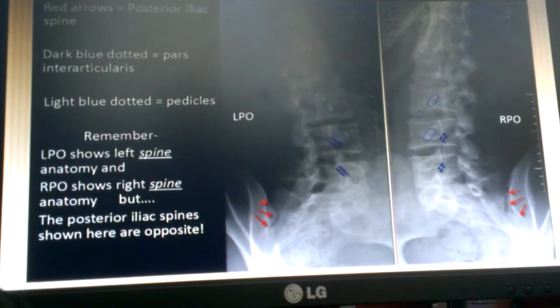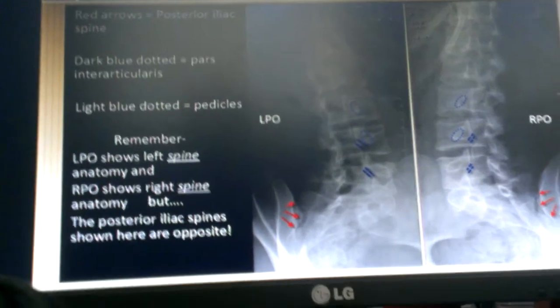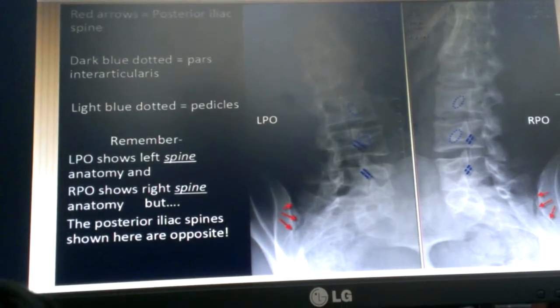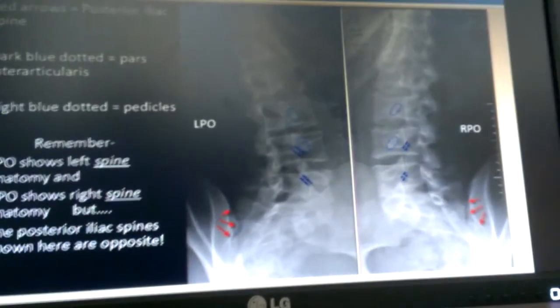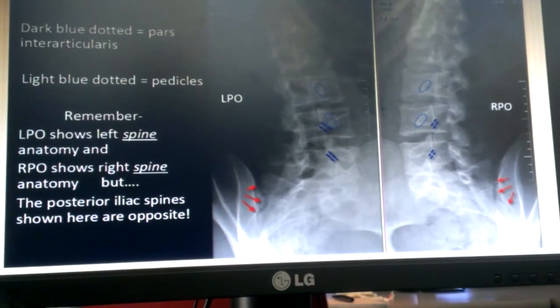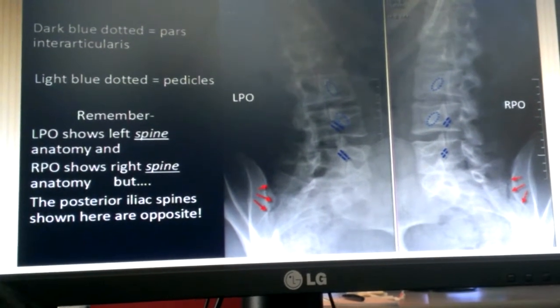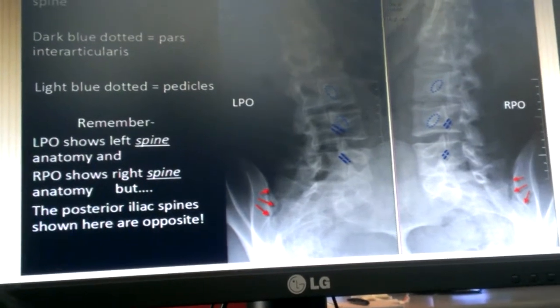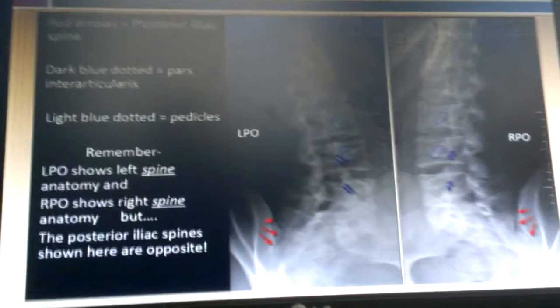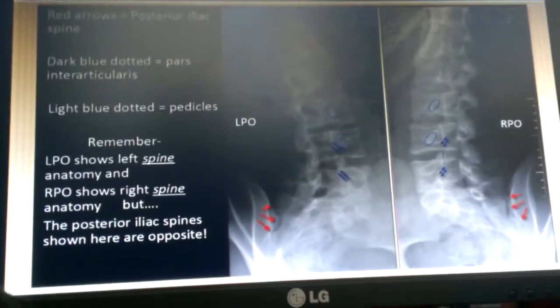However, in the lumbar spine, because we're looking at different structures, the pars, vertebrae and the articulations, if you shoot, for example, posterior oblique, you're looking at the same. So in the cervical spine, anterior obliques are the same as the shoulder that was touching, but in the lumbar spine, posterior obliques give you the same Scotty dog, or zygapophyseal joints apart, as the hip that is touching, right? So don't confuse the two.